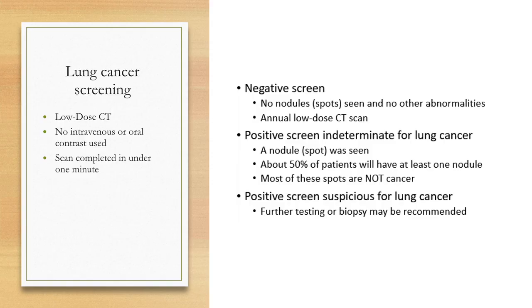What is a lung cancer screening study? We said it's a CT, but it's actually a really low dose CT. We're not looking at it to look at the vessels, the soft tissues, or the bones. We just really want to see the lungs. We find incidental things, but our main concern is to look at the lungs. So we don't use contrast, even though we're looking for cancer. We're just doing a quick CT. It's under 1 minute.